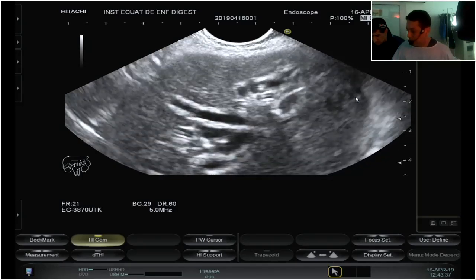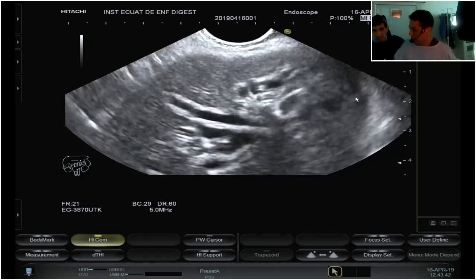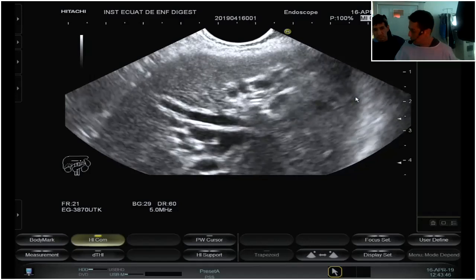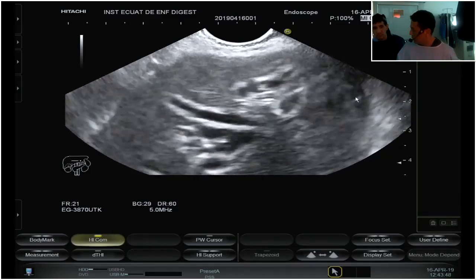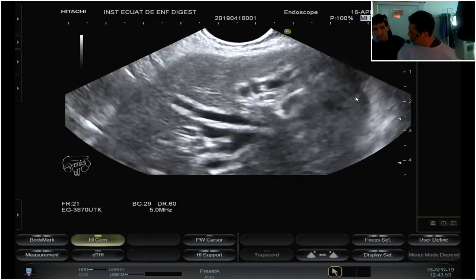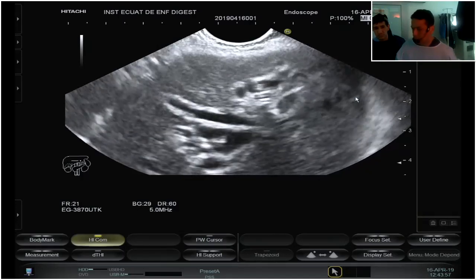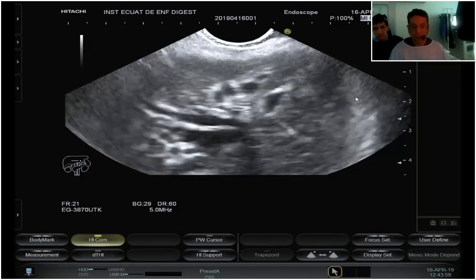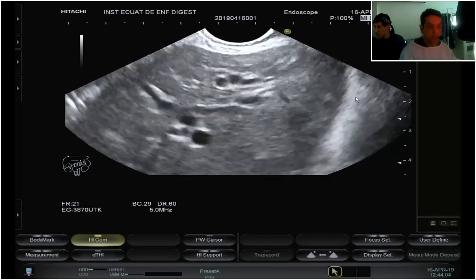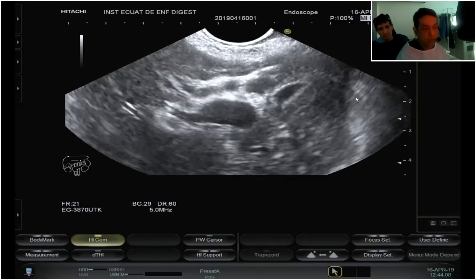So we will perform first an approach of the biliary tract, and try to perform an aspiration. Then we will do a cholangiography, and then we will evaluate what should be the next step. And finally, I will do a liver biopsy. So I think this is the best approach. We have a very nice case today to try to find a solution for this patient.